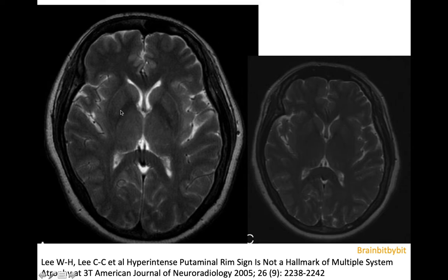Because on 3 Tesla, it might also be a normal finding. This is a healthy volunteer in her 40s on 3 Tesla, and this is the same healthy volunteer on 1.5 Tesla — it might be normal on 3 Tesla. So don't diagnose hyperintense putamenal rim and MSA on 3 Tesla, only on 1.5 Tesla.